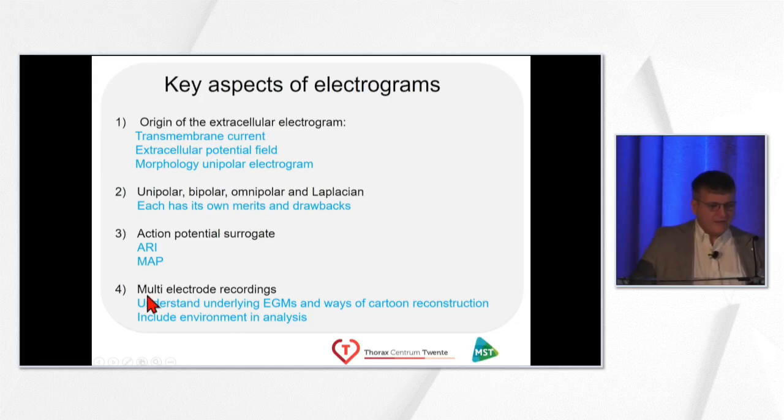And when you're looking at, of course, our business has improved immensely by sophisticated mapping tools, but always try and understand the underlying electrograms, because a cartoon made by a mapping system is only a model of reality and not necessarily the reality itself. And if possible, always look at bordering electrograms to analyze the electrogram under the electrode.